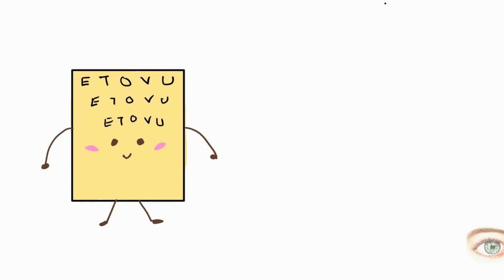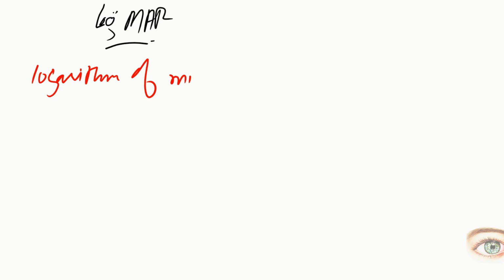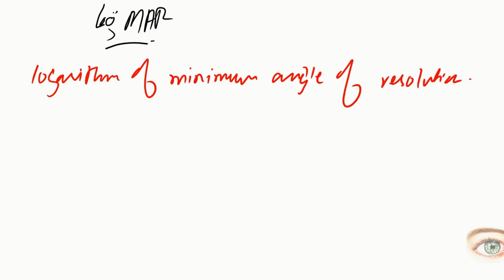And today we're going to learn everything about the LogMAR chart. So let's get started. When I was studying the LogMAR chart, the first question that came to my mind was: why do we call it LogMAR? The abbreviation LogMAR actually stands for logarithm of minimum angle of resolution, right? So now, what is this minimum angle of resolution?